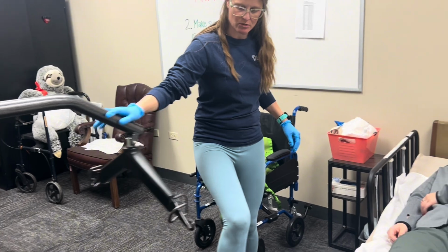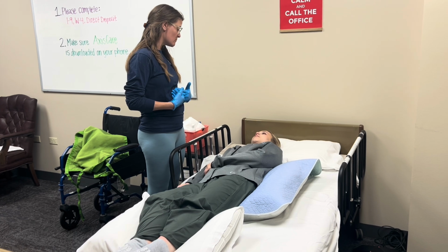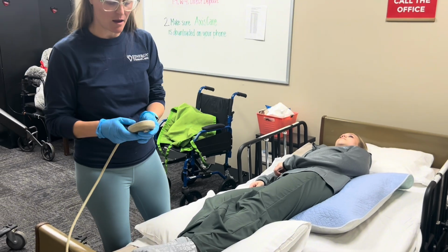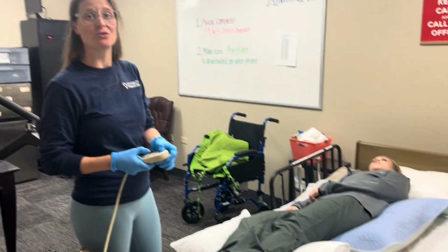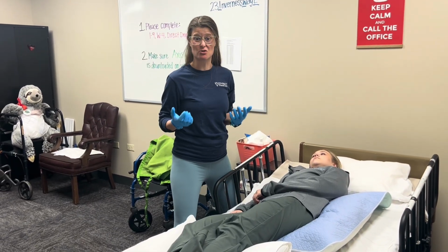So first thing that I like to do is introduce myself to our client just to make sure that they're nice and comfortable. Michaela, I'm Lisa. I'm your caregiver, and I'd like to help you get out of bed. You mentioned earlier you'd like to change positions and get to the living room. So as a taller caregiver, I'm going to adjust the bed. I'm going to bring the bed a little bit higher so that I don't have to lean as far forward. That saves my back, and that makes this a lot more comfortable. I'm also going to make sure I'm in a good position to help my client.